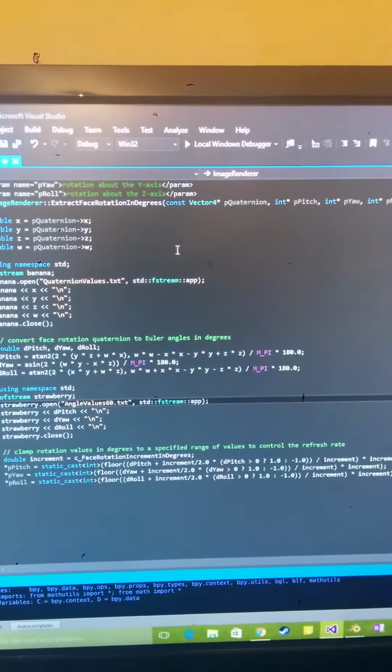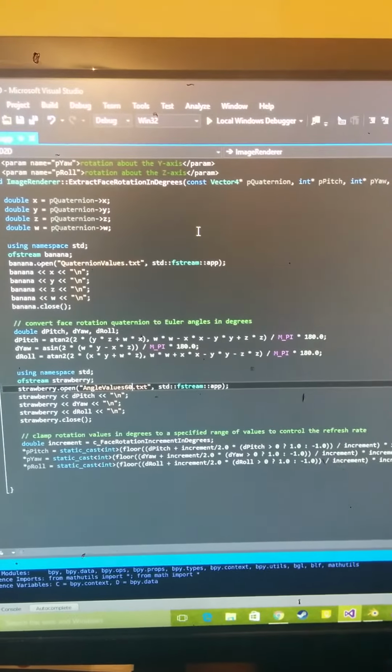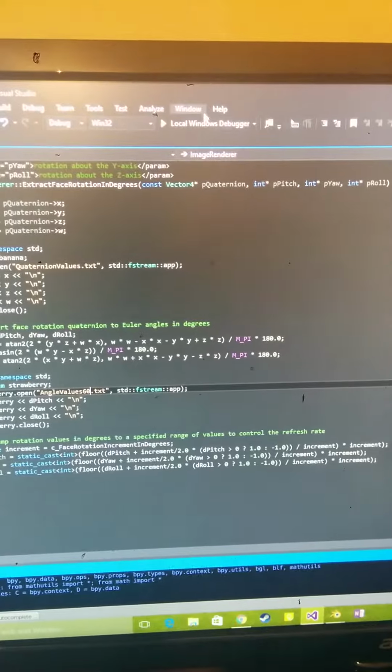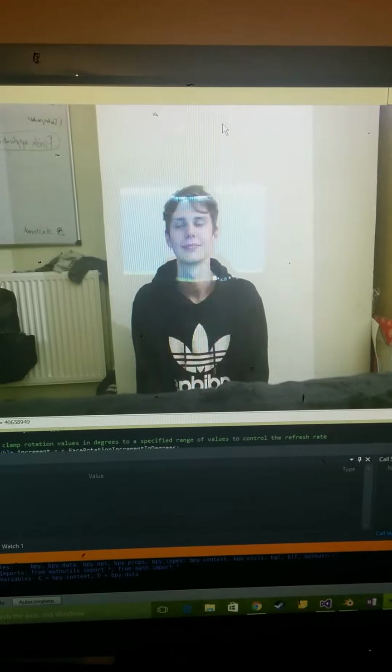This is a demonstration of the 3D CT projection system using Microsoft Kinect and a projector. The first step in using the system is to load up the Altered Face Basics code and press Run. The code will then open up a camera view from the Kinect system and the patient will be identified.